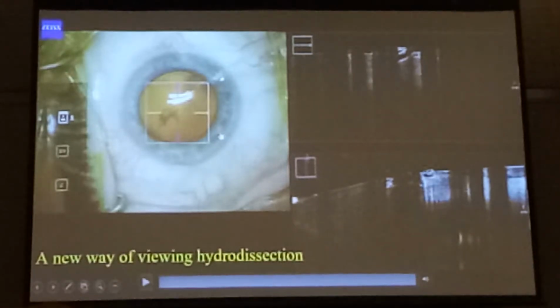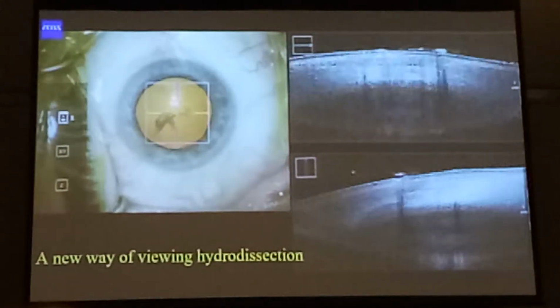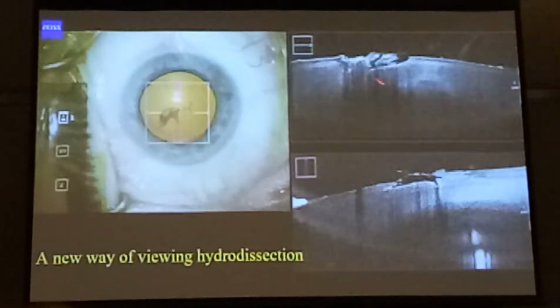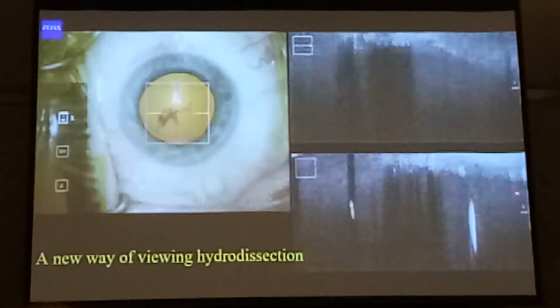phenomenon. So here's my live OCT, focused on the middle of the lens, and here's your side view. The blue arrow shows here, and here the red arrow shows this direction. Okay, now you can see that's the top of the hydrodissected CCC. The nucleus is disturbed there because my needle was there, and this one again shows the anterior surface of the lens.